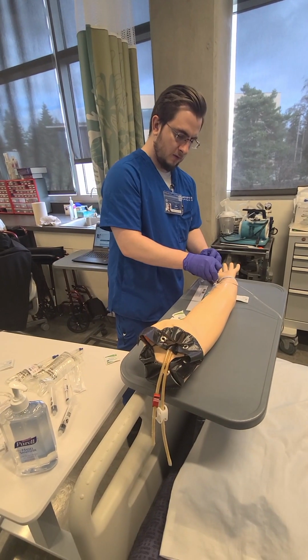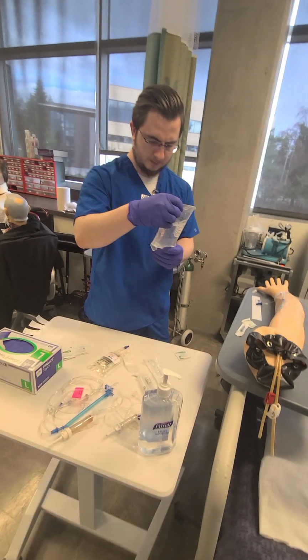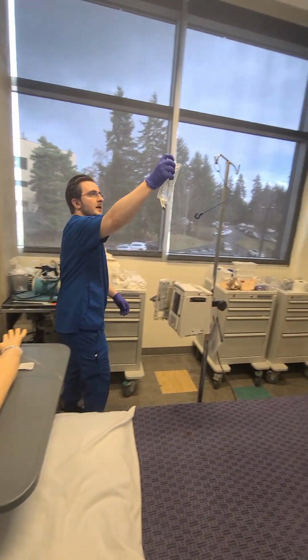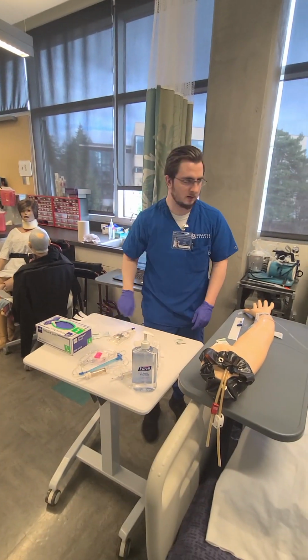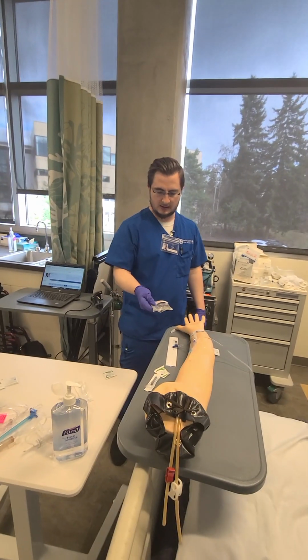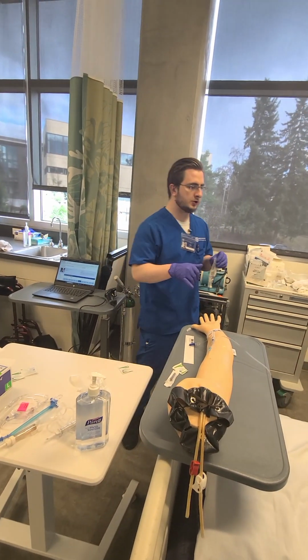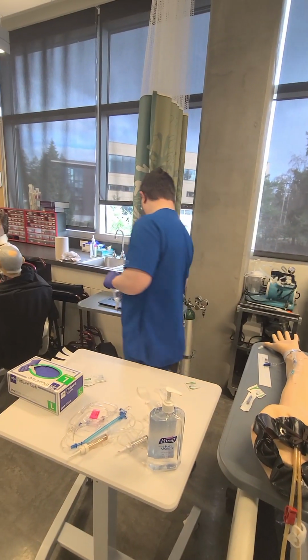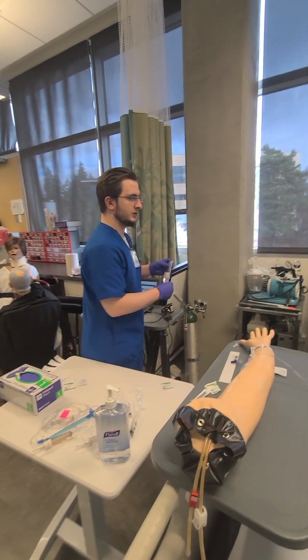Close this up for now. And then I'm going to get started on your ciprofloxacin. I got the regular right here. I'm going to prime my line. I scanned it in. I'd be going over my 5 rights right before I gave these again, as well as with my Zofran. Making sure that it's the right route, patient, dose, 400 milligrams. Make sure, again, my last checks here. 400 milligrams and 200 milliliters D5W.